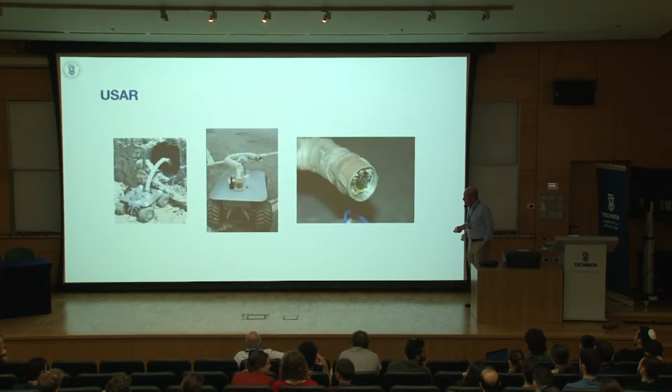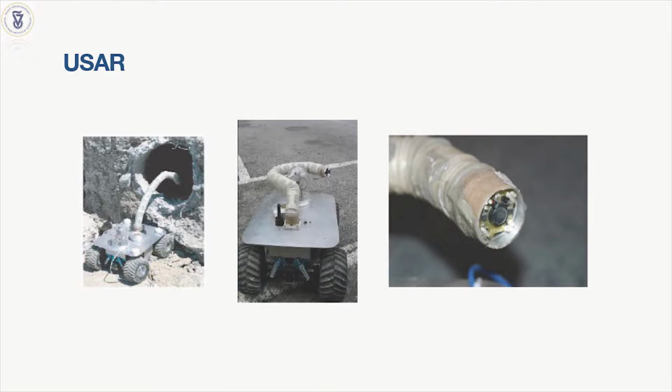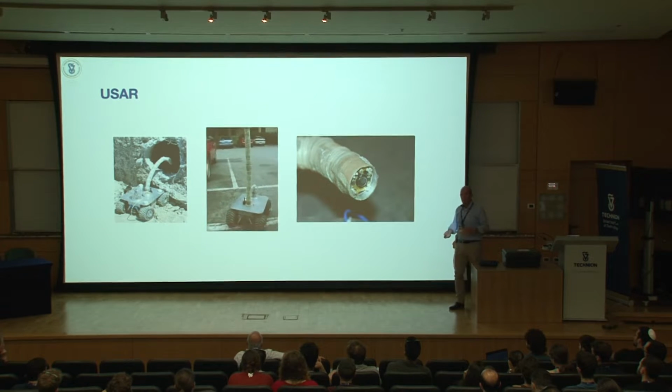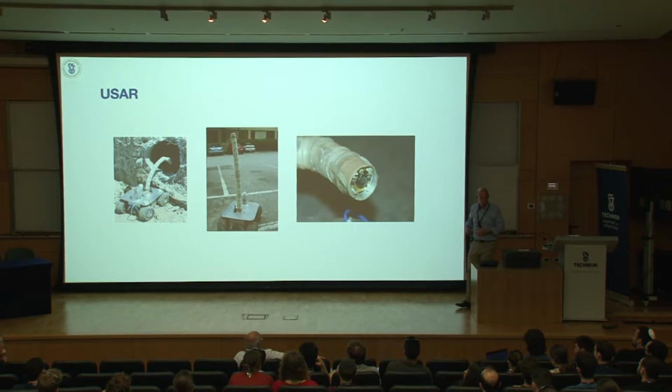And when we were asked to develop robots, this is 2002, this is the kind of robot we came up with: an elephant trunk-like, very flexible robot, 20 degrees of freedom, or 20 motors here. The robot has sensors embedded, and it extends the reachability of this hobby car that we bought in Toys R Us. Just to show that you drive and then you deploy a flexible arm and you can reach locations which are not in a linear trajectory.